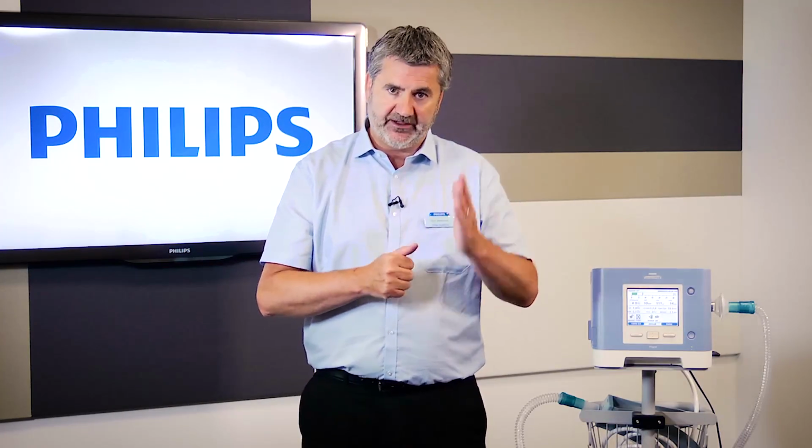How does it do this? Well, it does it breath to breath, looking for a draw of 6 mils from the patient. So that's all they have to do. It's a tiny, tiny little trigger from the patient, 6 mils. It's kind of like a teaspoonful of air. The machine then detects that and reacts up to the IPAP. It then detects their breathing out and very spontaneously, very quickly goes down to the EPAP.